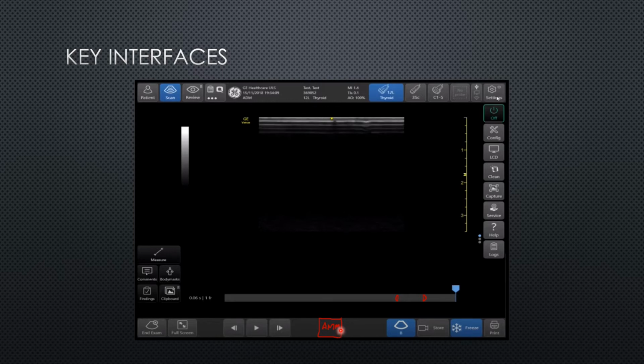So say, for example, you've got a clip of a parasternal long axis of the heart and you're trying to do an EPSS. Well, you can click this anatomic M mode, and it actually allows you, so say, for example, and I apologize, I'm not an artist, you have your phased array screen here, right? And let's say your septum is not quite perpendicular, right? Oops, you didn't quite do it right.